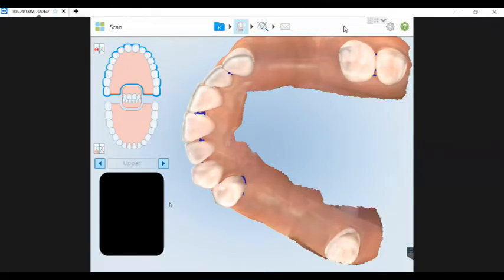So there is something called an Optragate, and if you've attended any of our other presentations, it is a disposable item, and it helps to retract the lips and cheek. There's also another device called ScanMate that's more like an instrument. It's an autoclavable black rubber handled item that you would use like a mirror, except there's no reflection to it.